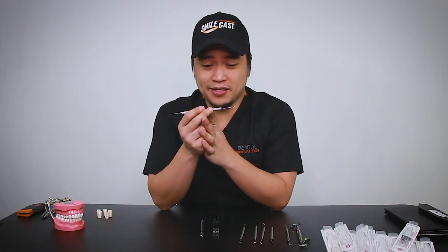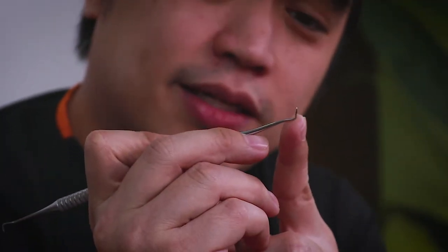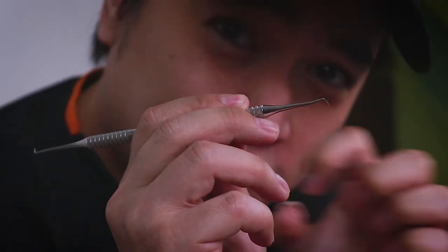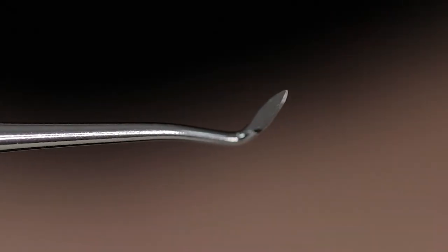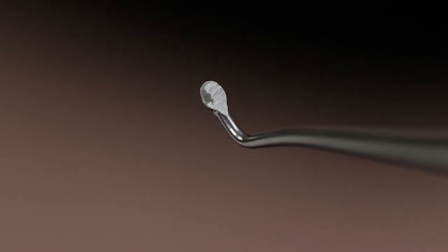Next, we have the clioid discoid. We have the sharp end and of course the disc end. With the sharp end, this helps with the final form of your amalgam when it's getting a little bit harder and you're trying to carve and make your line angles a little bit clearer. This helps a lot, especially that point right there, and of course removing a little bit of the excess is helped by this disc end.